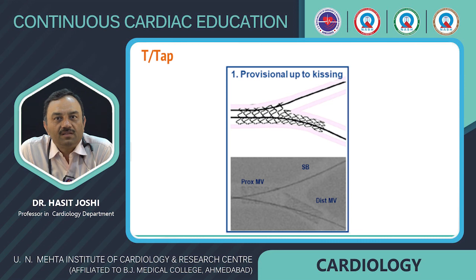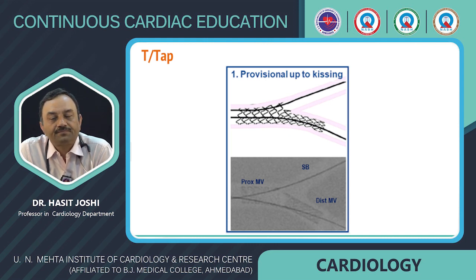Now the other two techniques which we are going to discuss today are more advisable. So the two stent strategy, T-tap or T strategy. Now the steps are still similar, repeat POT, these are similar.